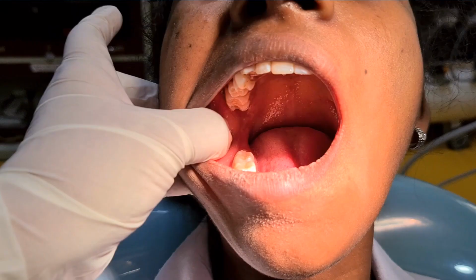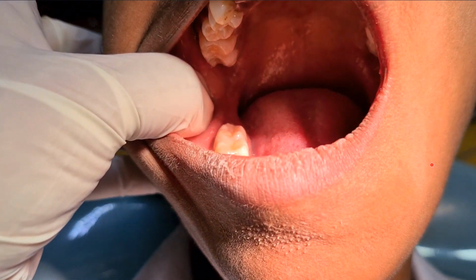Intraorally, if we were to examine the coronoid notch, we should ask the patient to open their mouth wide, identify the pterygomandibular raphe, which is the soft tissue structure that is present here. We retract the entire tissue buccally to visualize a pterygomandibular depression. So this is how it is done.